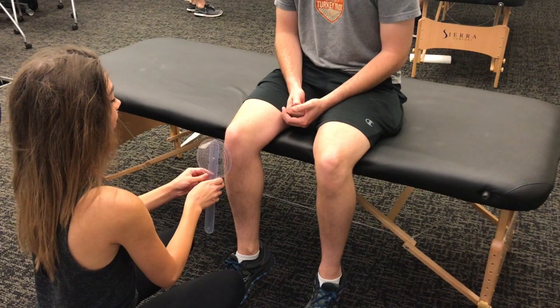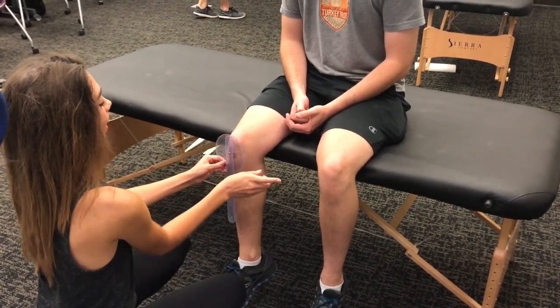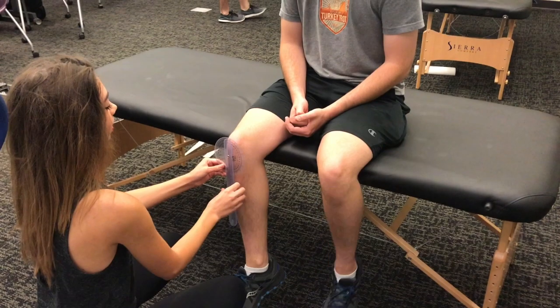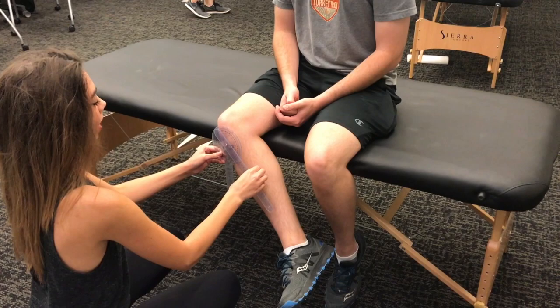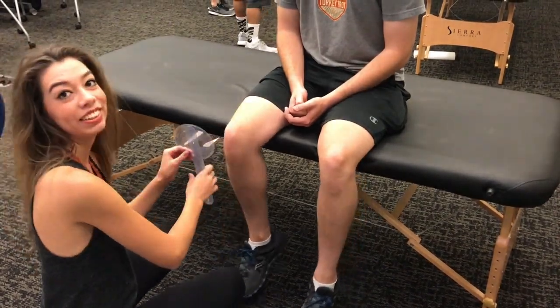Have your partner sit at the edge of the mat table with knees bent and dangling off the side. Have them move their heel medially as far as they can to measure hip external rotation. The axis of rotation is the anterior patella. The stationary arm is perpendicular to the floor and the mobile arm is aligned with the anterior crest of the tibia. His measurement is 45 degrees, which is the normal range of motion for hip external rotation.